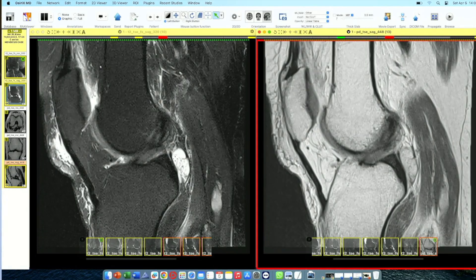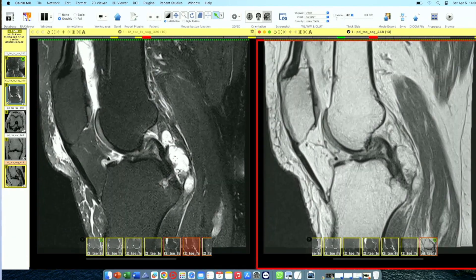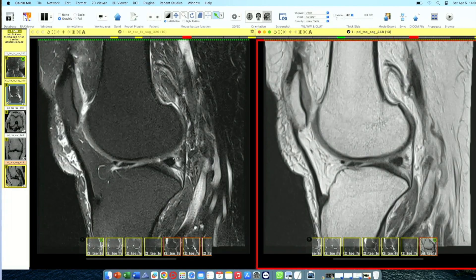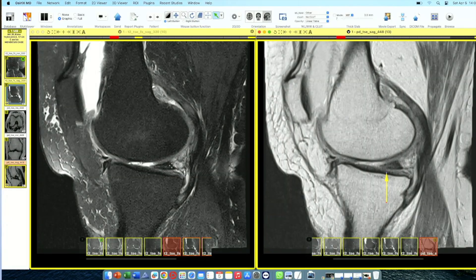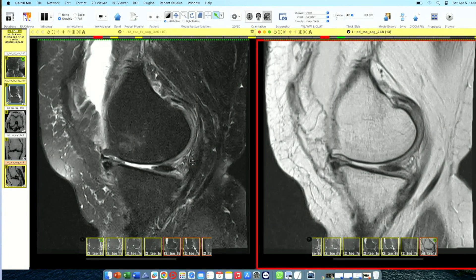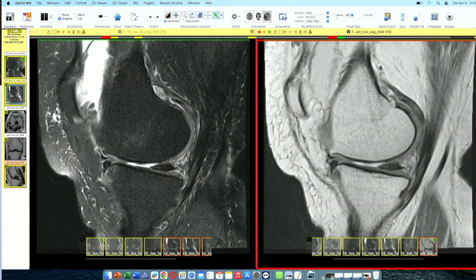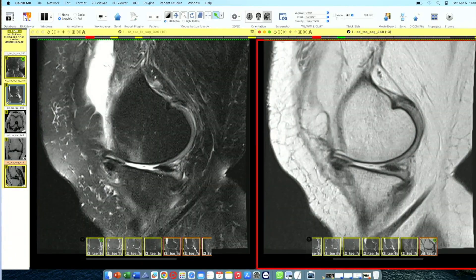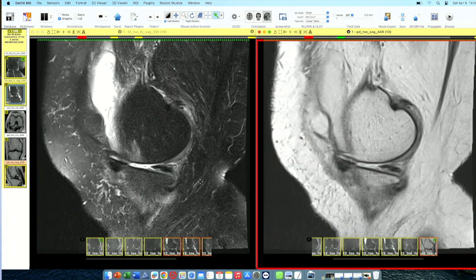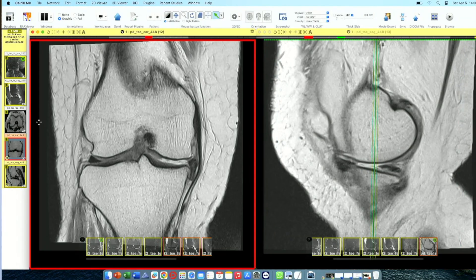As I go posteriorly, there is a large multiloculated parameniscal cyst in the midline, arising from this region because there is a complete rent — fluid is going out from this rent and forming a cyst. As I come to the periphery, the triangular bit of the meniscus is maintained, but when I come to the periphery the inferior part is missing — only the superior part is visible.